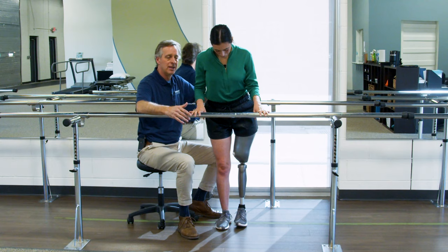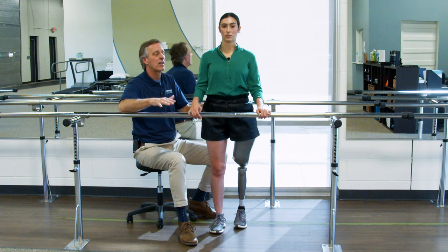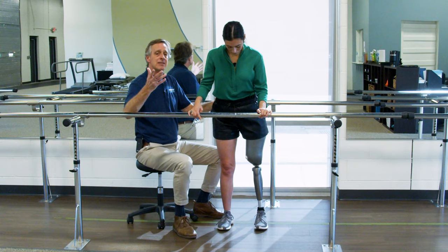the air for a second, long enough if they are tripping to be able to move their foot to a stabilizing position. If they're about to step in some oil or water, they think, oh, I could change and move my foot to a different position. But if I'm falling off the prosthetic always and not really got it underneath me for stability, I'm likely to fall during those positions.